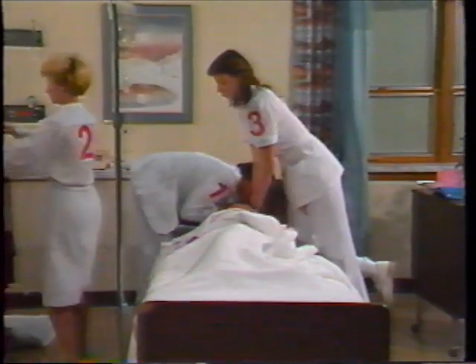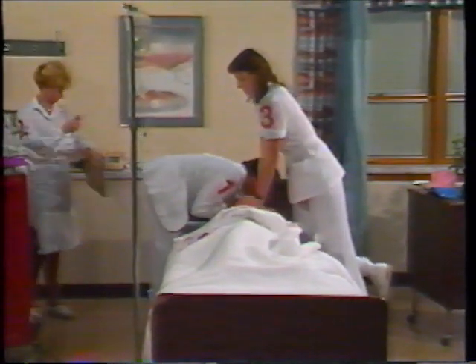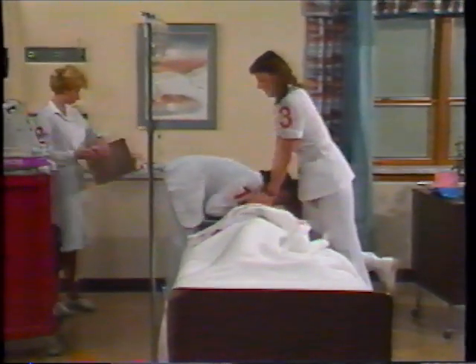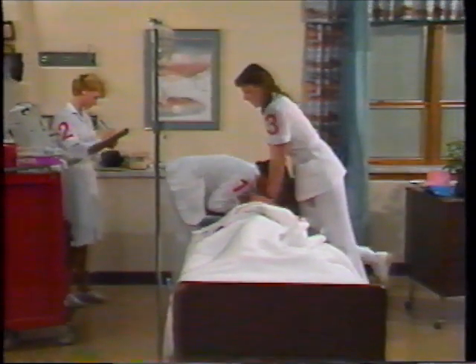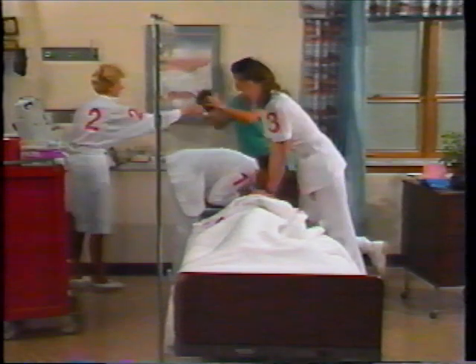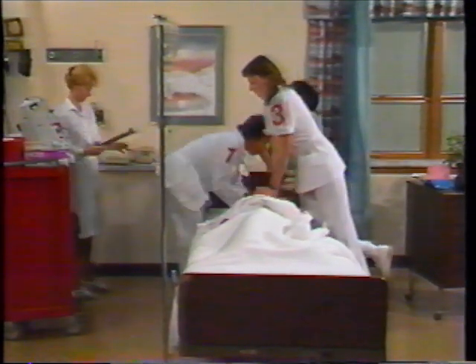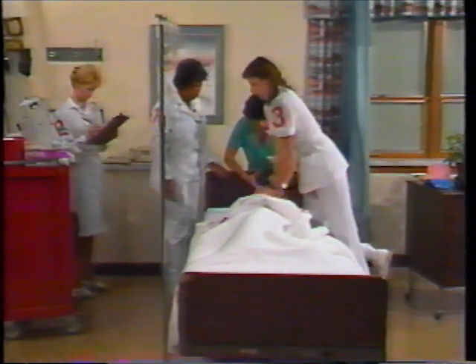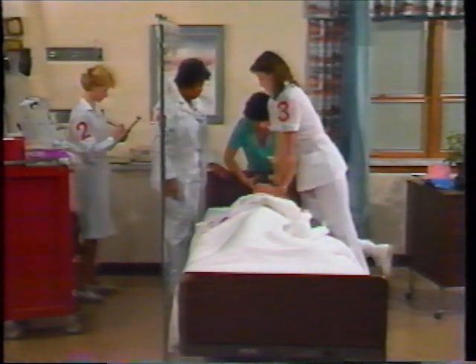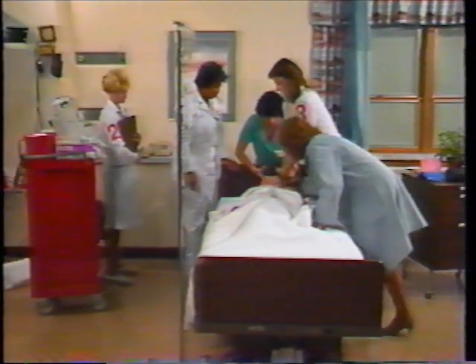1 and 2 and 3 and 4 and 5. I have the ambu back, please. There you go. 1 and 2 and 3 and 4 and 5. Stop for a minute.